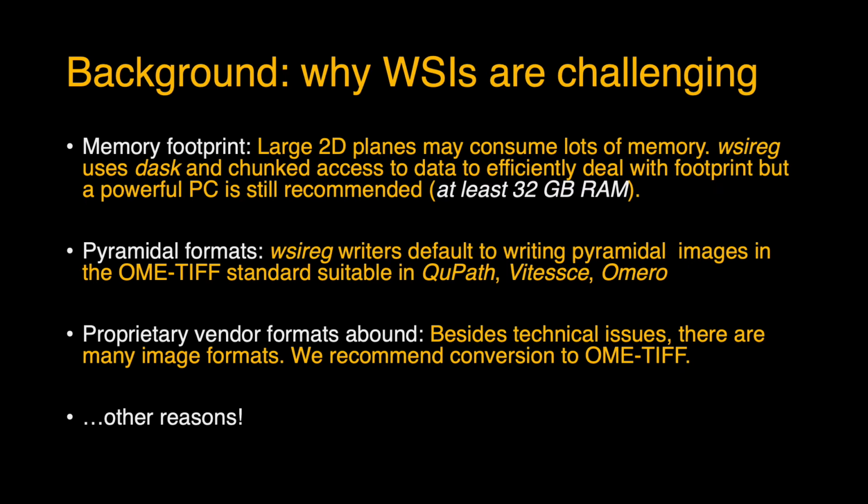And another issue with this is that there are proprietary vendor formats. So every vendor that sells a slide scanner of any kind is going to have their own format. So obviously we recommend conversion of your data to OME TIFF. It will simplify all processes involving wsireg, but we do have minor support for some, for instance, Zeiss images within wsireg. And obviously everyone's going to have their own reasons why this particular task is challenging for them.